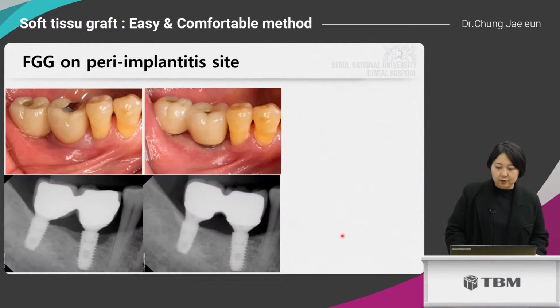The abutment and the crown were also remade. First, the crown margin is raised above the gingival level. In this way, cement removal is easy, and since the crown abutment interface is not located subgingivally, it is advantageous to maintain periodontal health. Looking at the X-ray, there is a defect filling here to compare with the previous X-ray.